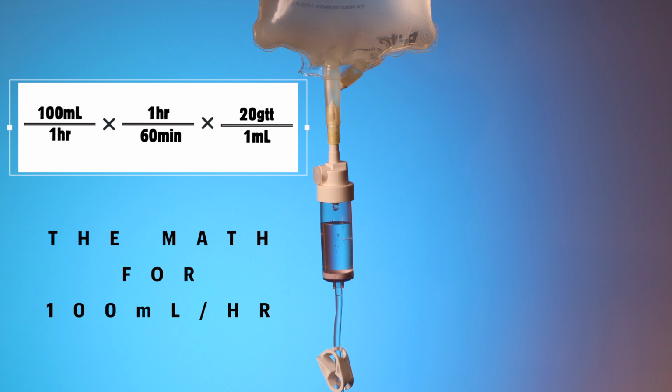This is our third drip rate of 100 mLs per hour. You can see the math on the screen here.